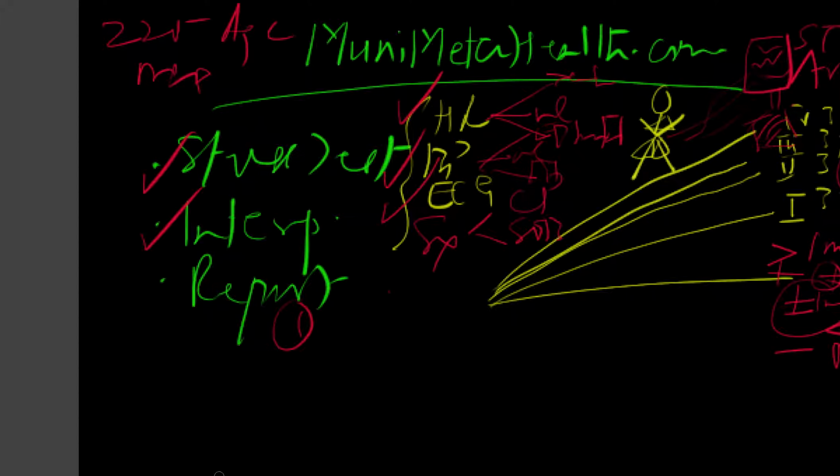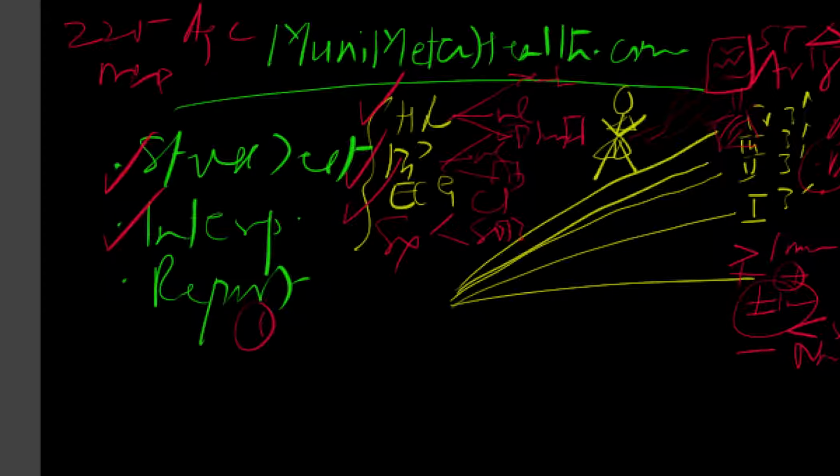Why? Because once you know your heart rate is, say, 180, then you know exactly how the person is performing. So 220 minus the age, say the age is 40, and then obviously the heart rate is about 180. So maximum heart rate can be about 180 for a 40-year-old individual, and then you stop the test. Then you say maximal heart rate achieved, test was limited by the maximum response of the heart rate, number one.